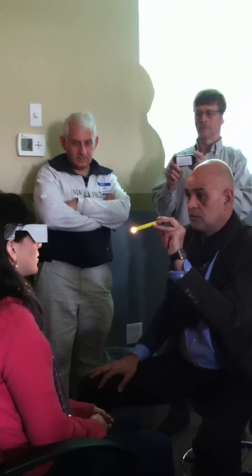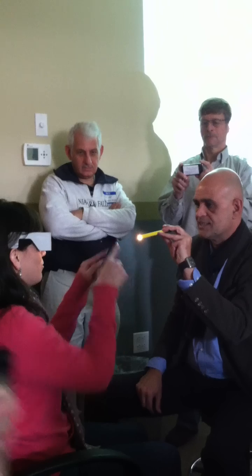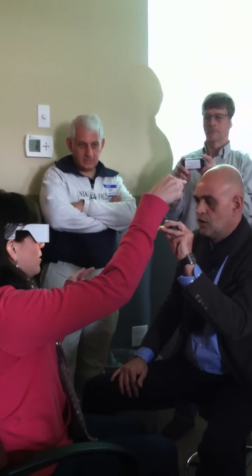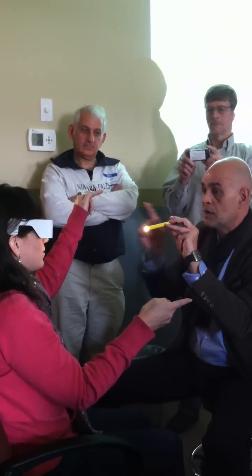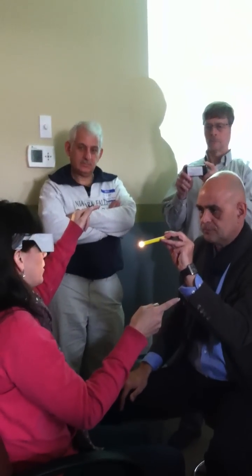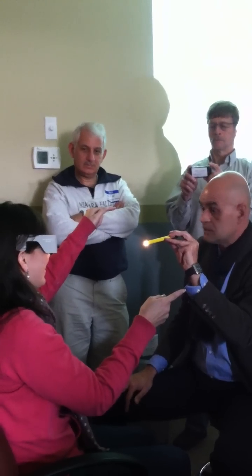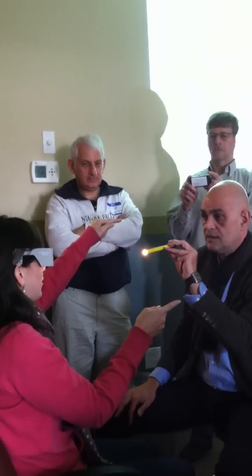Now you come back in the middle. Are they equally long? And now you touch the bottom. Yes. And now right up, left down. Right up, left down. So what you see here — displacement. And now left up, right down. Now you keep your hands and move again, a little bit lower. Maybe you have to change your hands because your hands have to touch the lines. You touch, and then you try to do both together to be the same. It's confusing, I know.